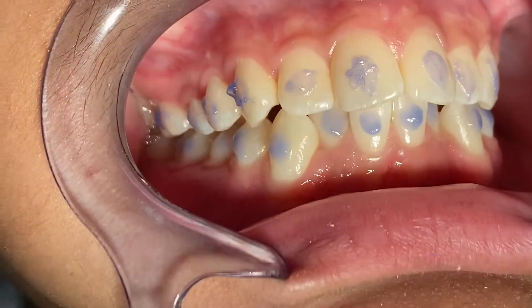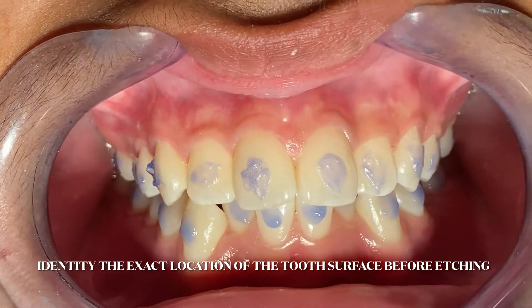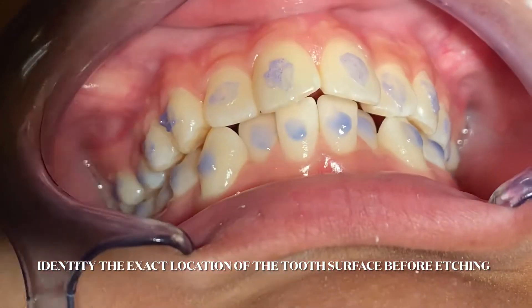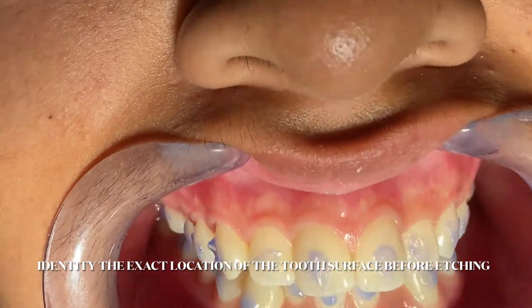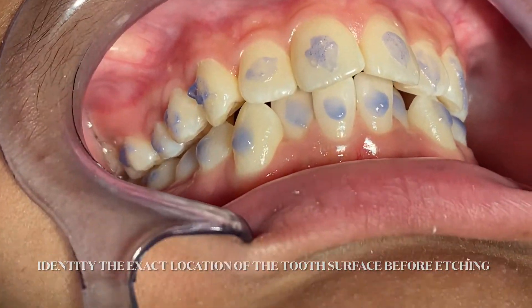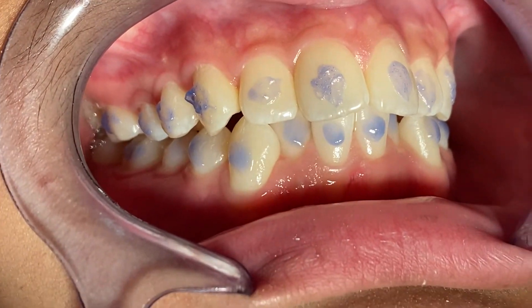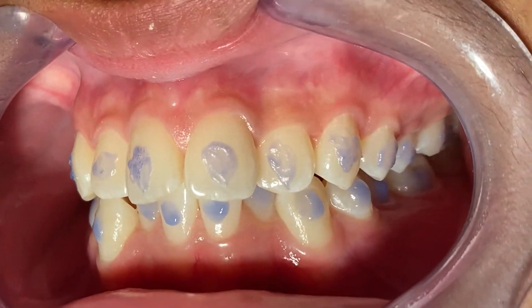That's good and bad, but I think if you identify exactly where you're going to place the brackets, you don't need to etch the entire enamel, making the tooth weaker. As you can see, I put it only where I want to place the brackets. This allows you to really identify where you want to be when you place the brackets.